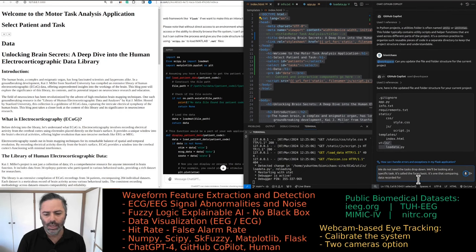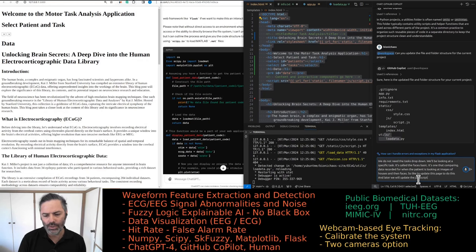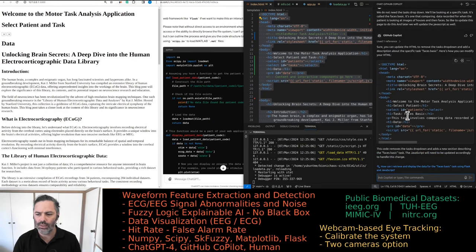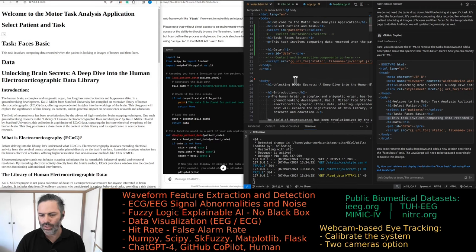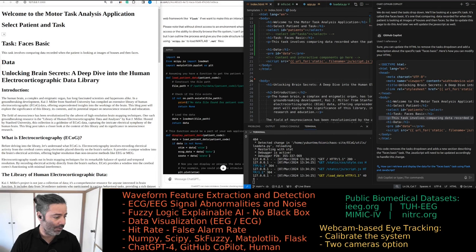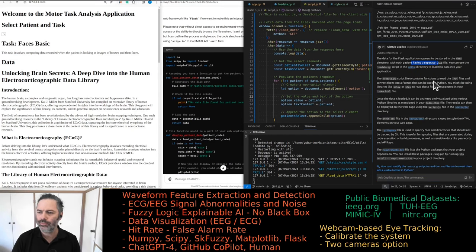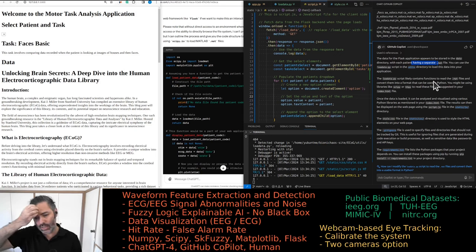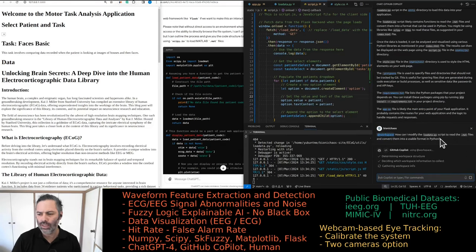We do not need the tasks dropdown — we'll be looking at a specific task called faces basic. It's the one comparing data recorded when the patient is looking at images of houses versus faces. I'd like to update this page to do this. It's not a motor task — we'll have just the one dropdown for the patient and populate it from the folder structure. Each patient has a separate .mat file where the data is stored. You can use the load data script in the utilities directory to load the data.